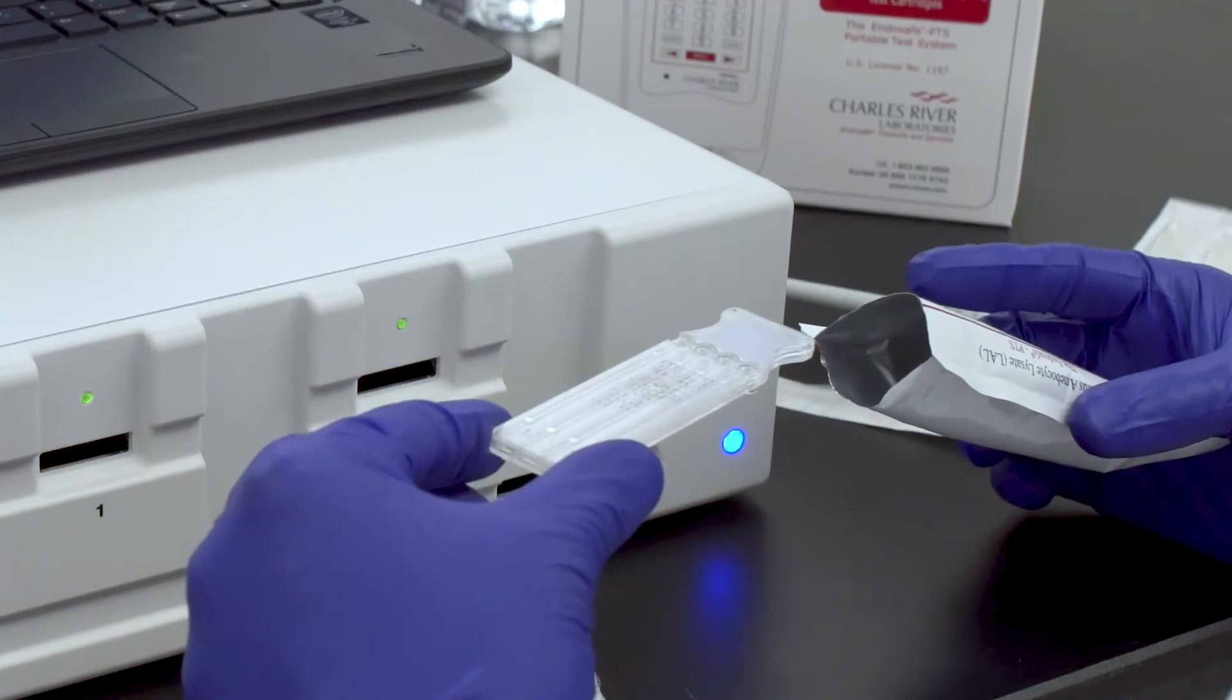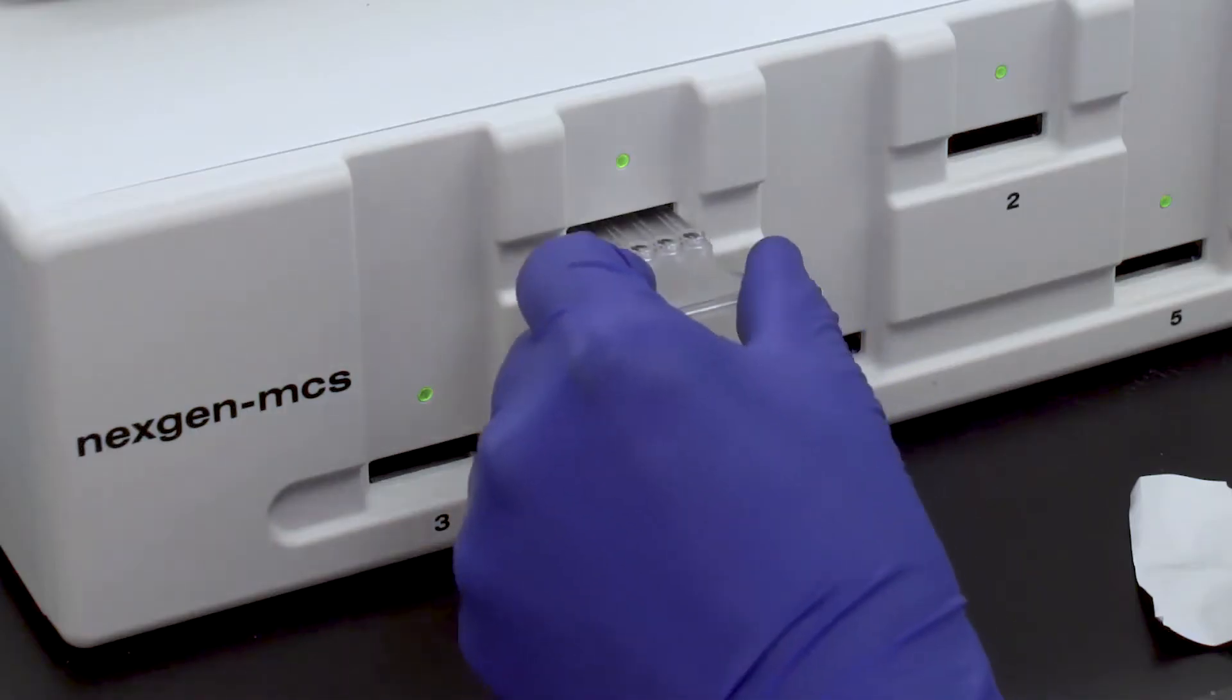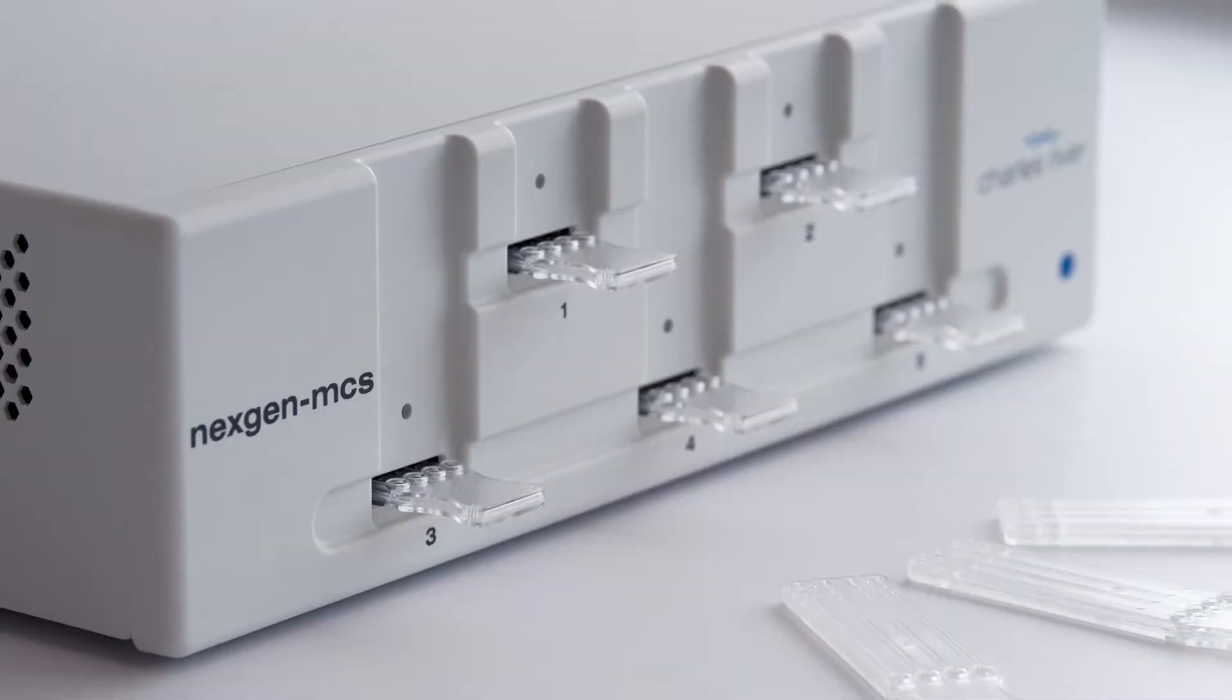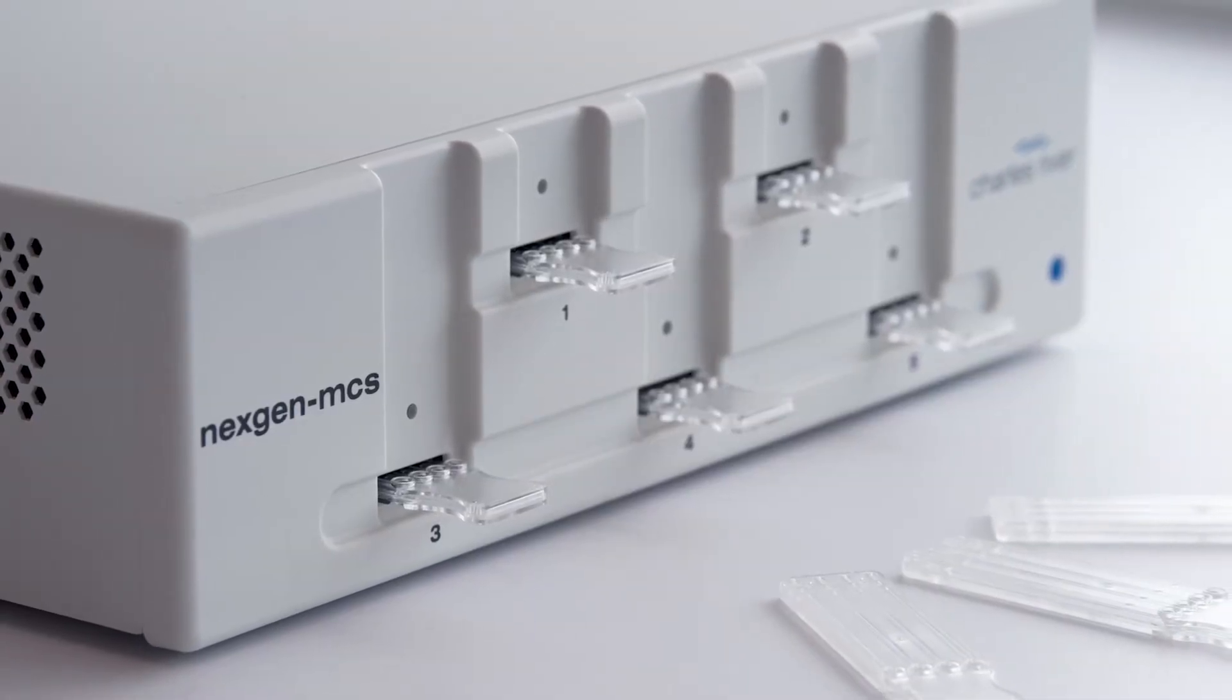Once the cartridge is fully removed, touch only the handle end of the cartridge as you begin to place it in the first bay of the reader with the wells facing up. The reader has an engagement mechanism to ensure the cartridge is securely inserted into the system.